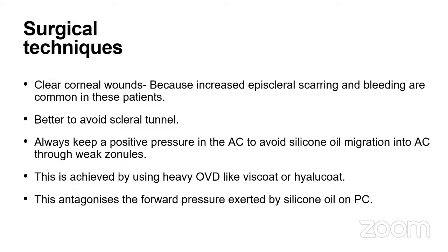Silicone IOLs are not preferred because the silicone oil may get added to the silicone IOLs and form opacity in the IOL. So acrylic or PMMA IOLs are preferred. If the plan is to implant the IOL in the sulcus, then three-piece IOLs are preferred. Both hydrophilic or hydrophobic IOLs can be used.